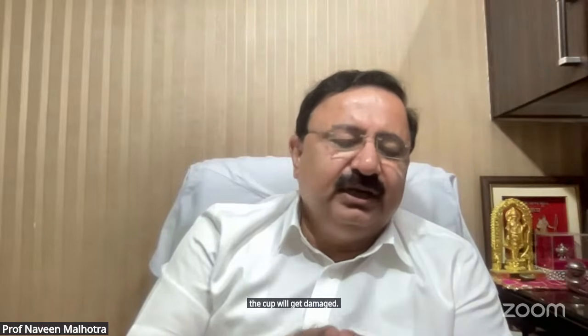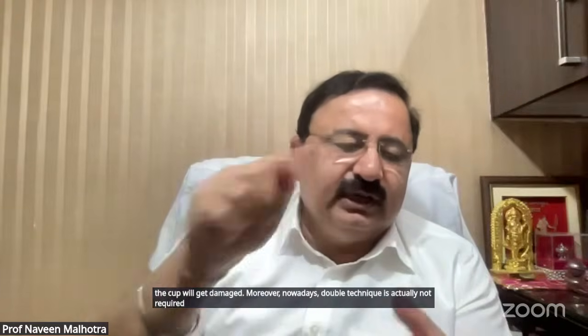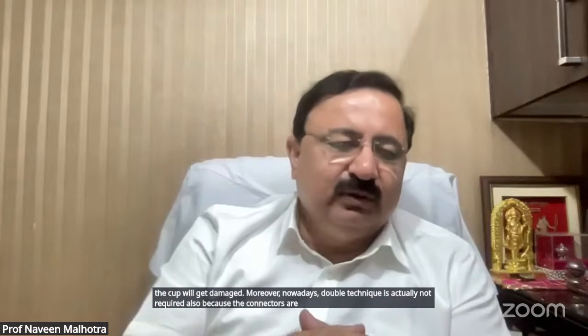Moreover, nowadays the double tube technique is actually not required also, because the connectors are easily removable. Yes sir, but we did it just for the experience. Okay, fine, fair enough. Thank you, sir.